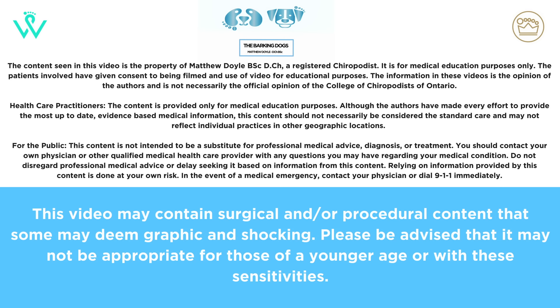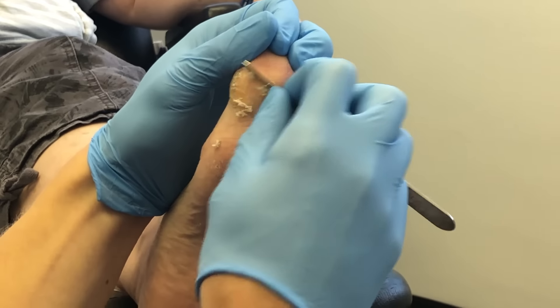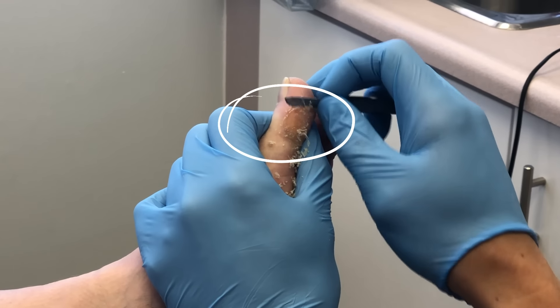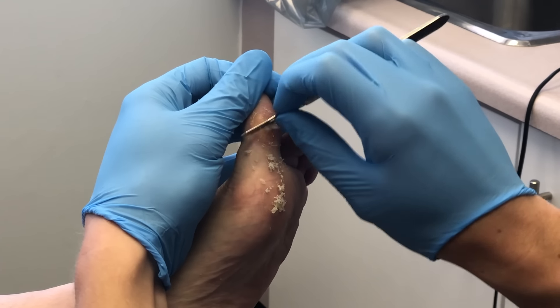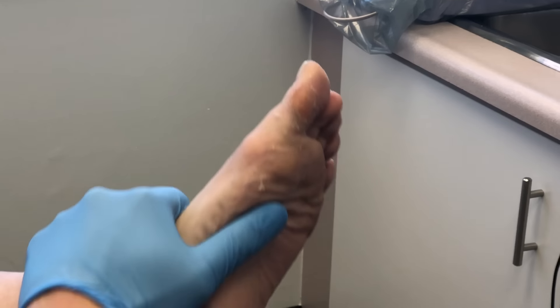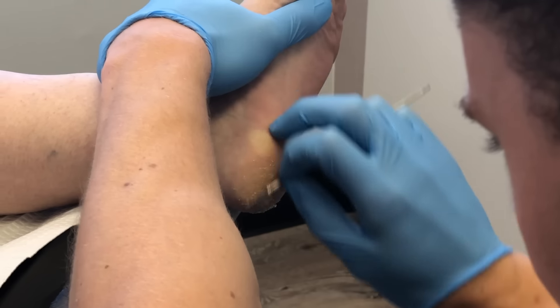Hey YouTube, it's Matt. We've got a video here showing some routine foot treatment. We're working on the IPJ — the interphalangeal joint of the hallux — debriding using a 10 blade and scalpel. The number one thing you want to do with the scalpel is to remove all the dead tissue and make sure that there's some skin tension, which is why you can see we're pulling the toe back.